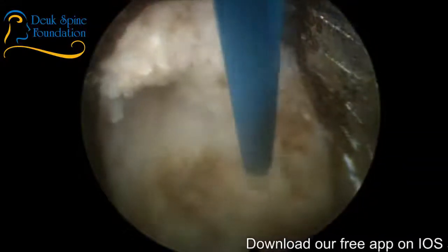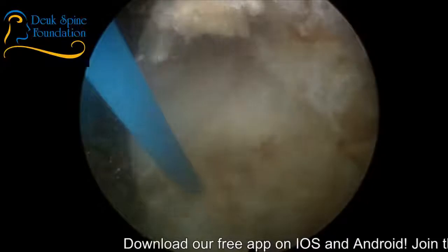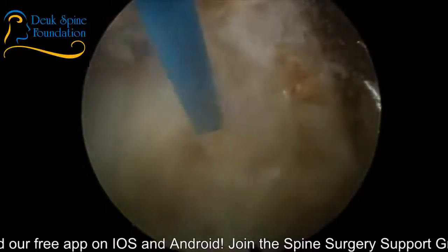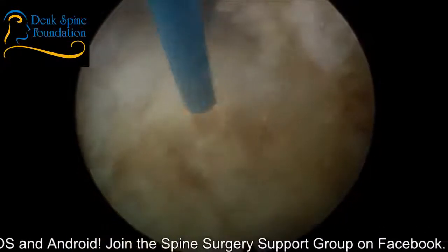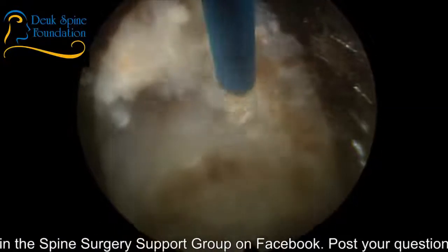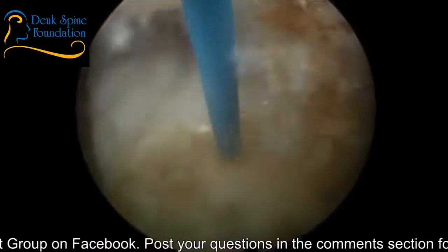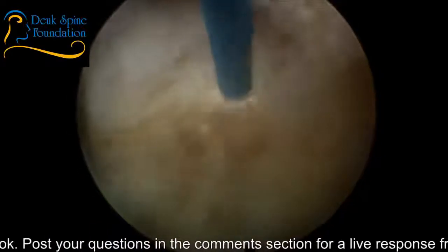The end plate of L5-S1 is right over there at 3 o'clock. The end plate of L5 would be at 9 o'clock, and I'm working between the end plates right here where there's scar tissue, where the herniation was. So I'm just slowly blasting little pieces off. And I'm not doing it slow for any other reason other than it's just not possible to do it faster because of the angle that I'm working at with the laser and the scope. So that's the back of the disc herniation right there, that white thing I'm blasting. Y'all see that? That's the annular tear.